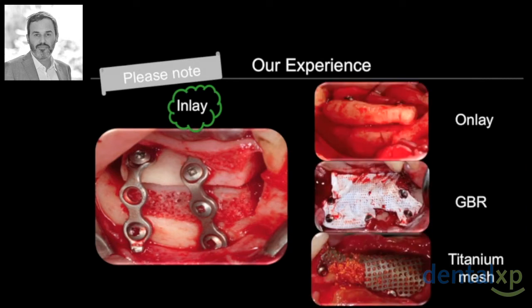This is why I prefer to use the inlay technique in the posterior mandible, because in this case, the graft heals more quickly. It is more protected, and after 4 months, we inserted the implants.